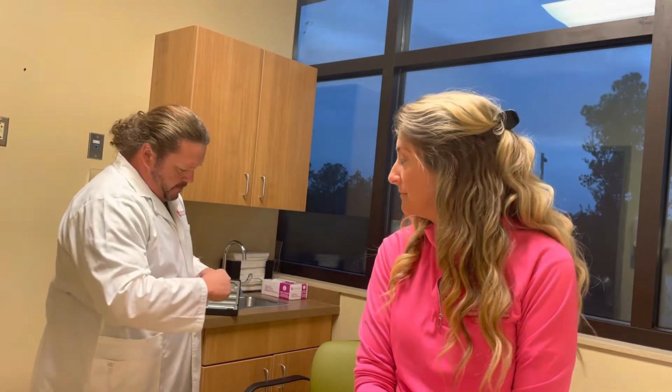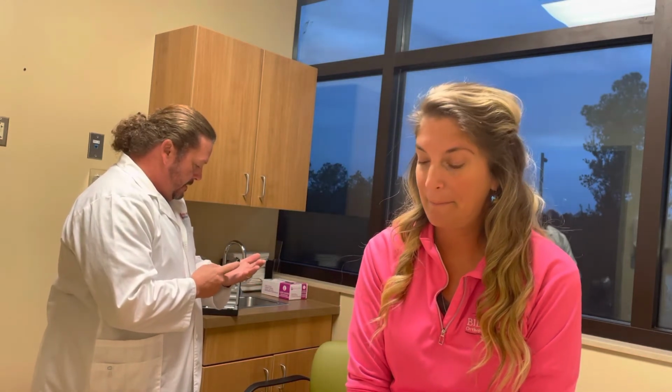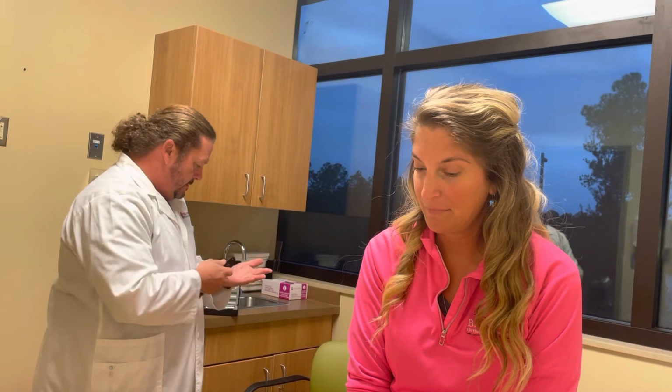I'm going to get my trusty fundoscope or ophthalmoscope, if you will. And I'm going to make sure that that's working, and we have the brightest aperture set on there. All right, so also have you stare straight ahead, just from a tangential view, which means from the side.